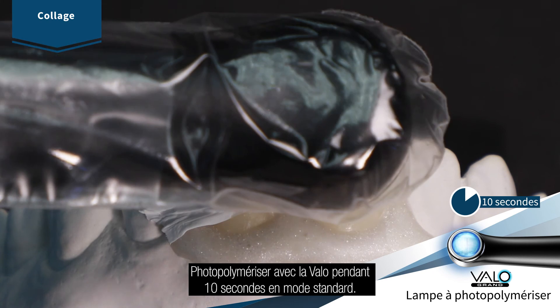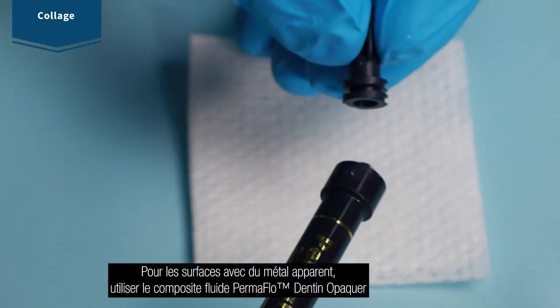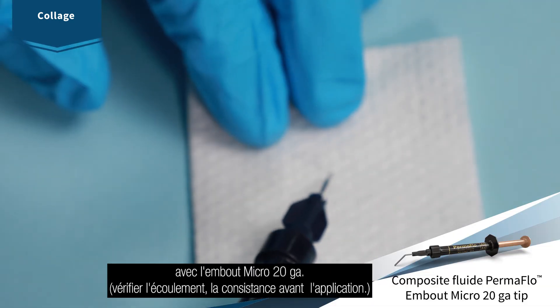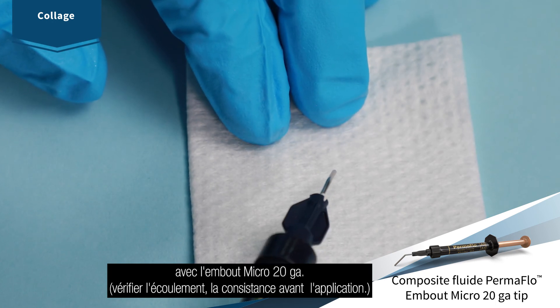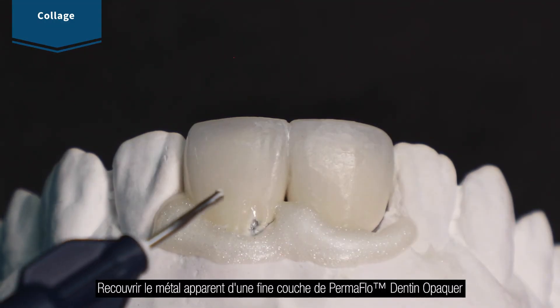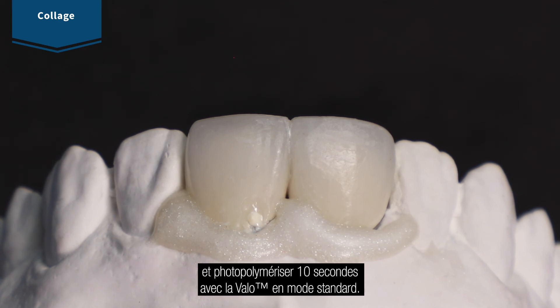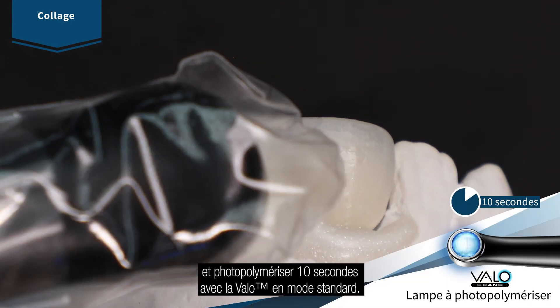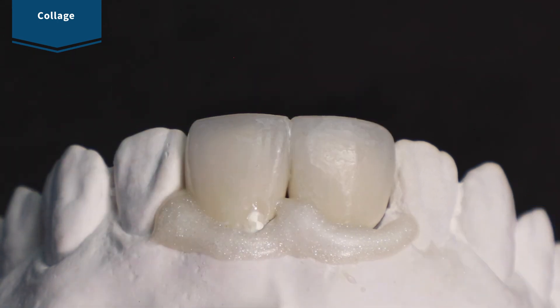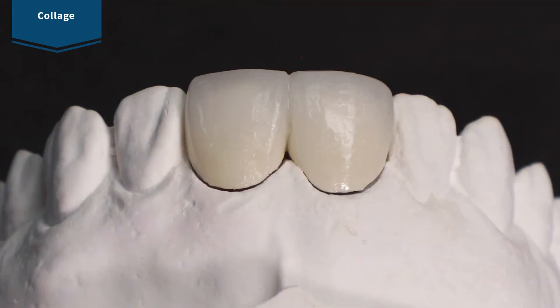Light cure with Velo curing light for 10 seconds on standard power mode. For surfaces with exposed metal, use permaflow composite dentin opaquer with the micro 20 gauge tip. Verify flow and consistency prior to applying. Apply a thin coat of dentin opaquer over metal and light cure with Velo curing light for 10 seconds on standard power mode. Complete the restoration with composite.